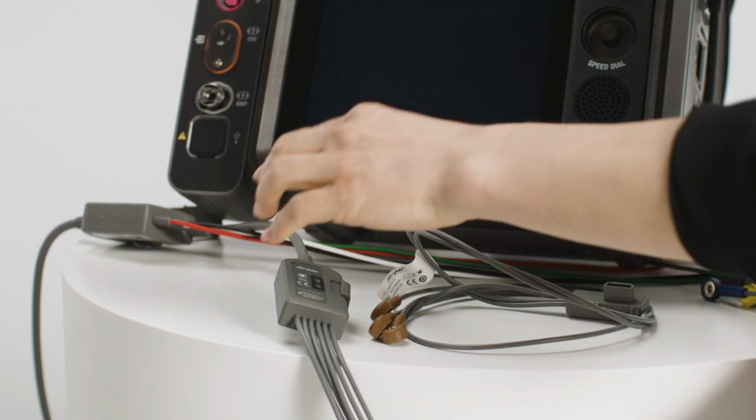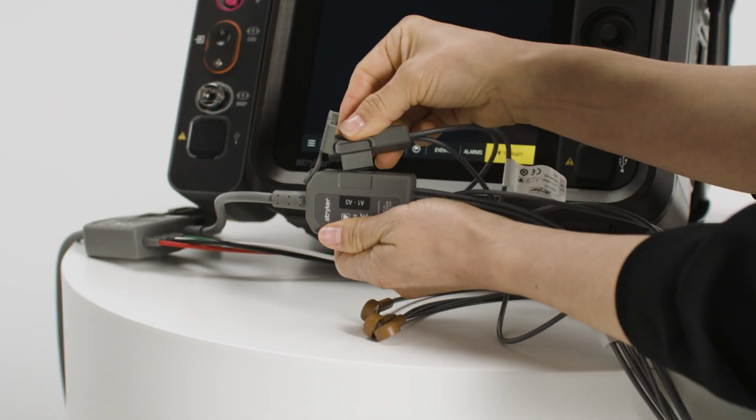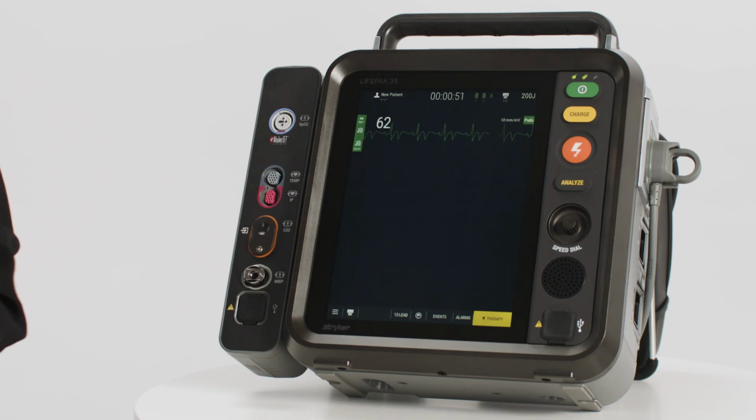To obtain a 15 lead, attach the additional A1 through A3 wires to the precordial wire cable. Then connect them to the electrodes on the right side location or on the posterior location. To access the 12-15 lead feature on the device, find the 12 lead button on the bottom of the screen. When this button is pressed, you will enter Live 12-15 Lead View.